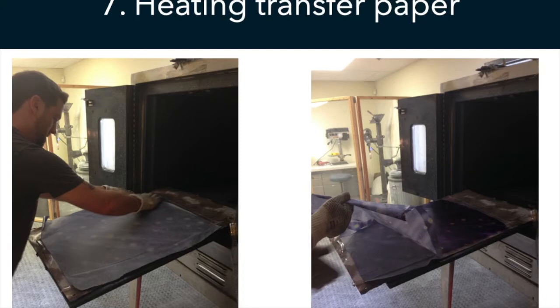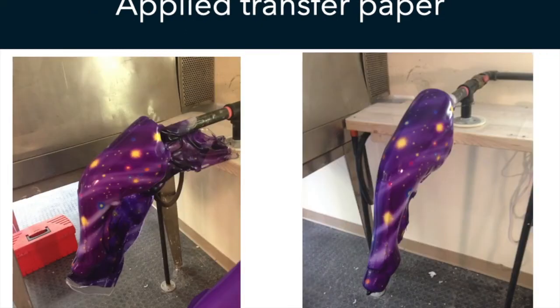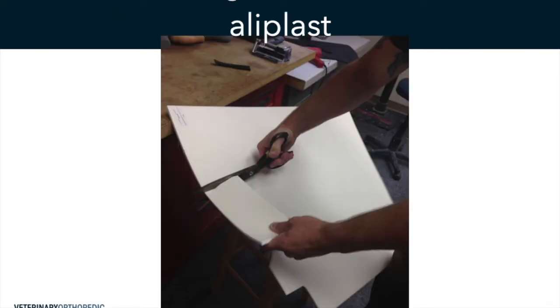Then he's going to do a heat transfer of the paper. And what you do then is you actually apply the transfer paper. So you can see here, that was the plastic material, the mold, and then this is the transfer paper applied now over top of the actual device. And there's all different types of transfer papers, you name it. It really depends on your personal choice as to the different ones that you would want for your pet.